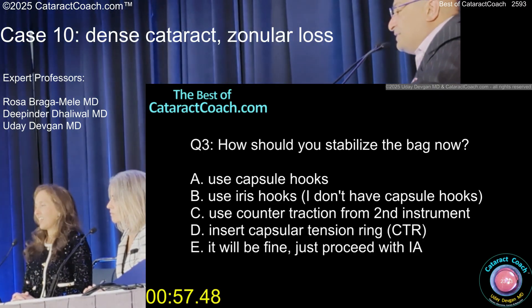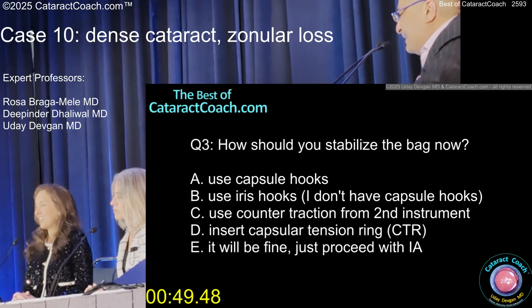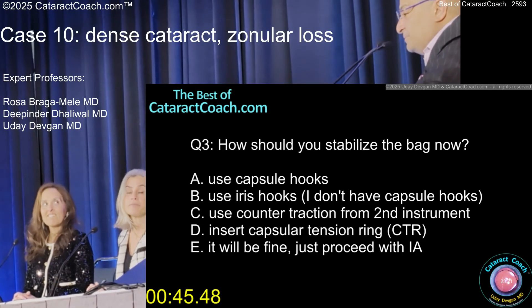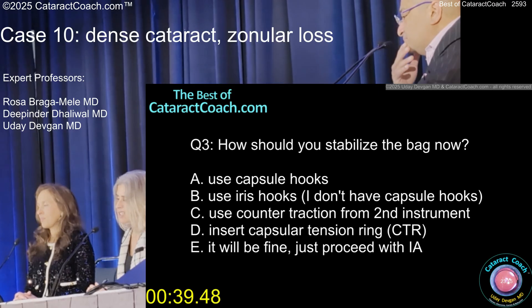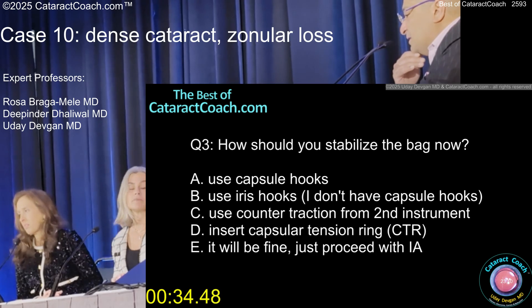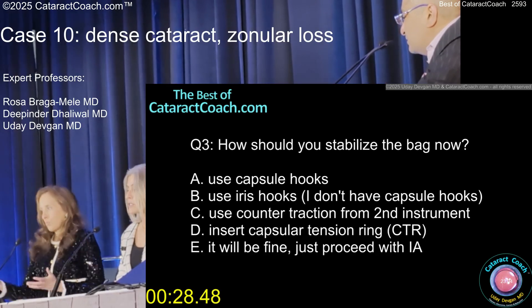Wow, look at that nucleus! I gave the patient that as a souvenir. Now how are you going to stabilize the bag? Do you put a CTR in now? Do you use iris hooks? I don't have capsular hooks. Just use counter-traction from the second instrument? It'll be fine — I put a capsular tension ring in now. Viscoelastic in the bag, viscodissect, then CTR. There's not much cortex — no need for hooks.